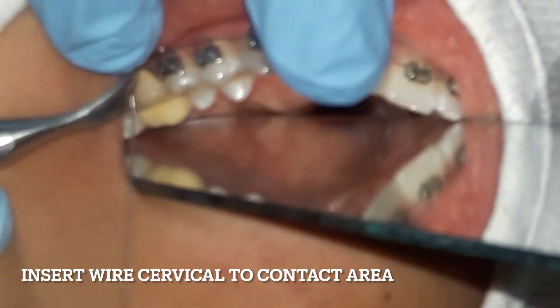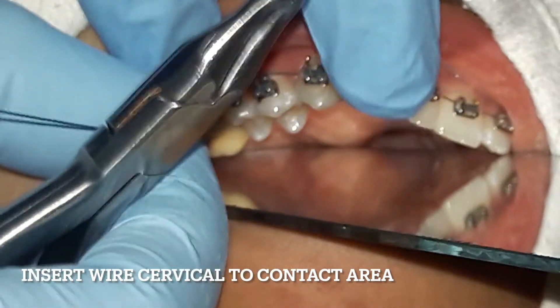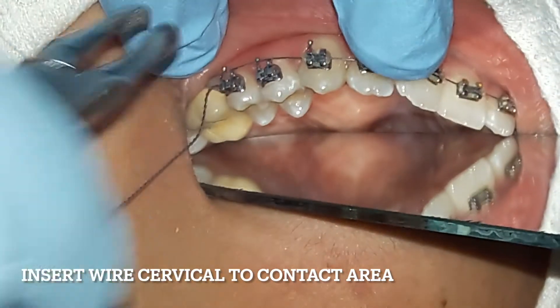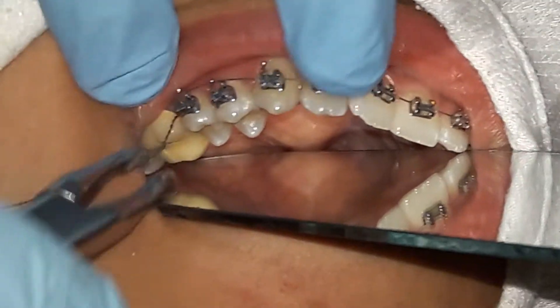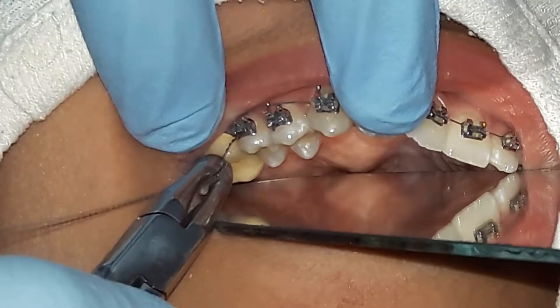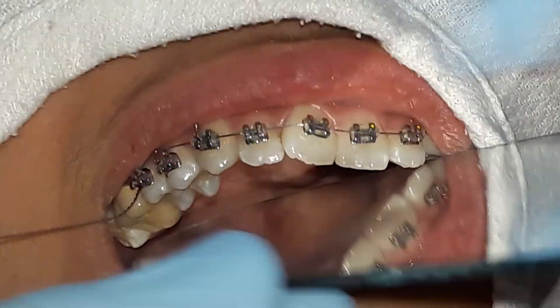I inserted the wire between the second premolar and the first molar, apical to the contact points or contact areas. You have to be gentle and careful when doing this maneuver so as not to excessively traumatize the proximal areas of tissue.